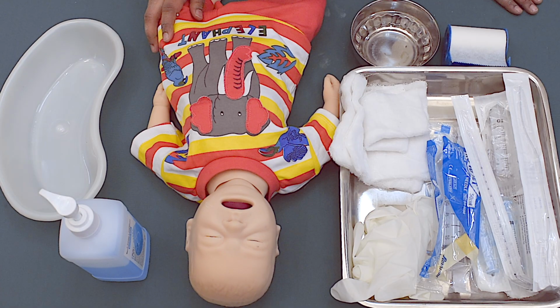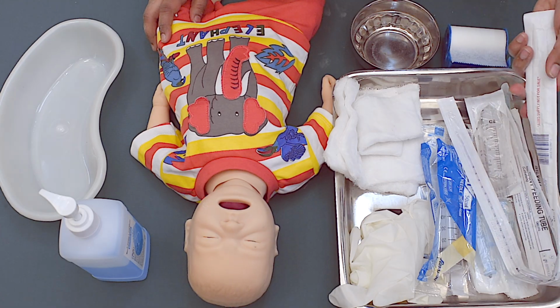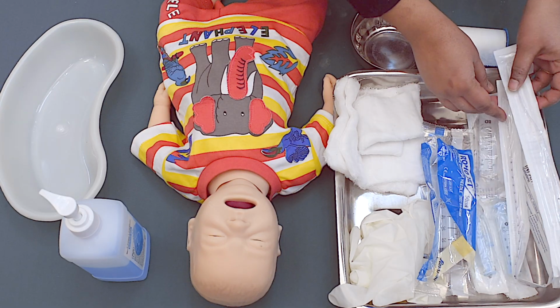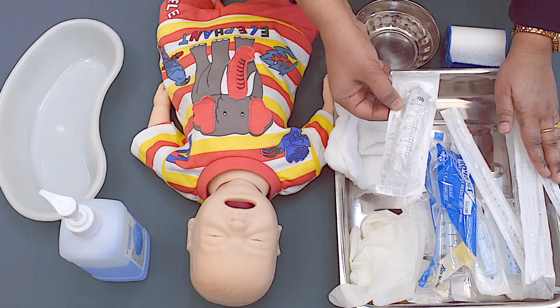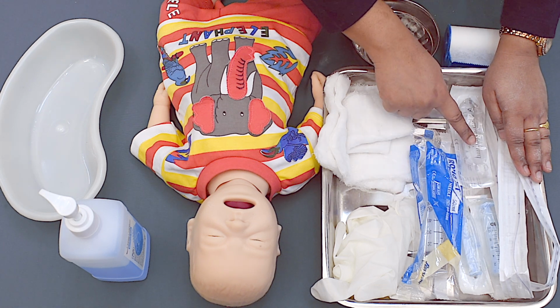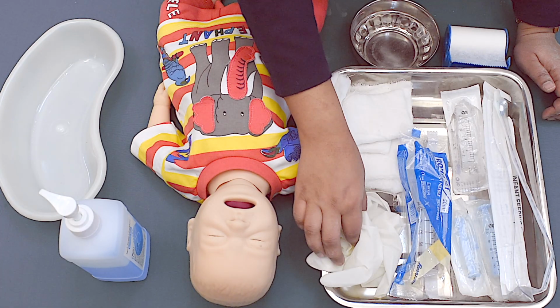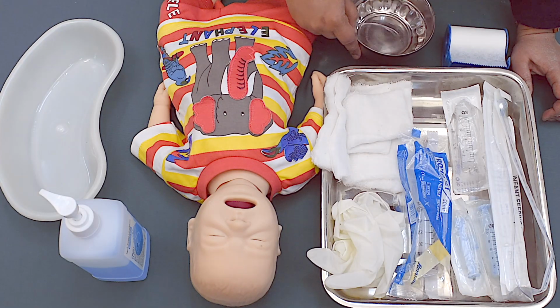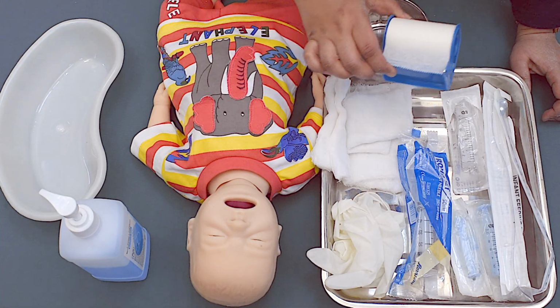So for the procedure, we need a tray containing nasogastric tubes or Ryle's tubes of appropriate sizes. For infant feeding, we need a catheter of 5 or 6 French size. We need syringes of various sizes: a 5 cc syringe, a 10 cc syringe, a 20 cc and a 50 cc syringe for children, a pair of clean gloves, a bowl of water to check the placement of the tube, feed in a bowl, and an adhesive plaster.